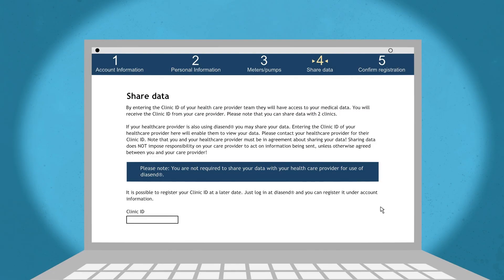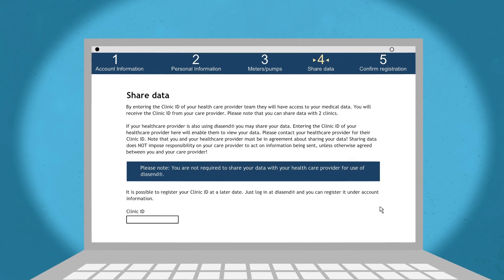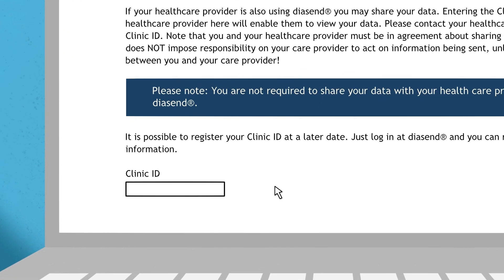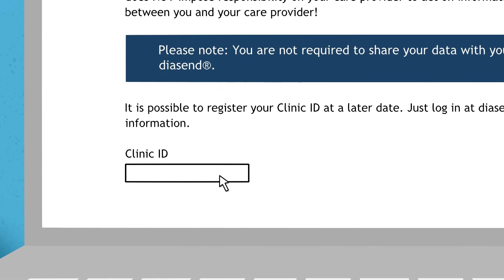In step 4 of the registration process, you're asked whether you would like to share data with your clinic. In order to do so, you need to enter the clinic's clinic ID. If you do not have the clinic ID at the time of registration, you can add this in your Diacend account later on.